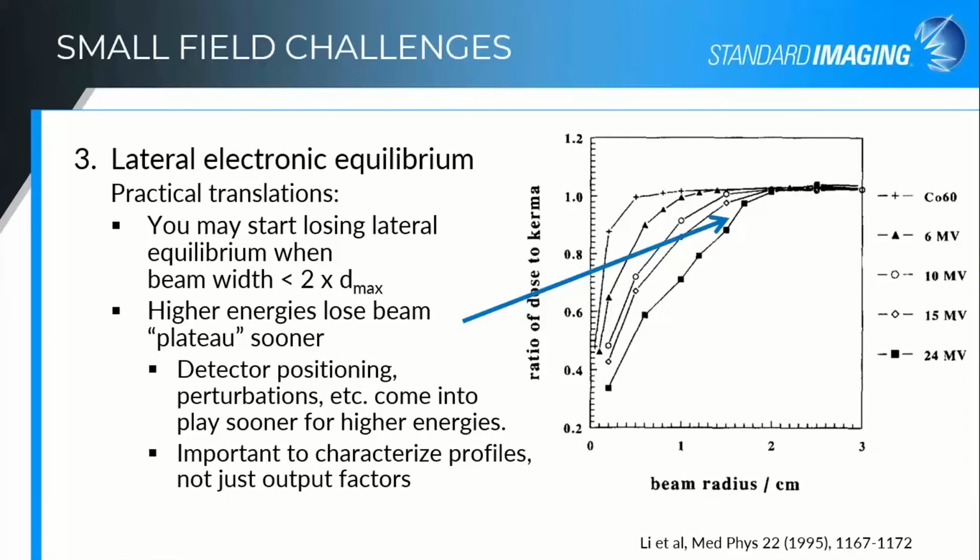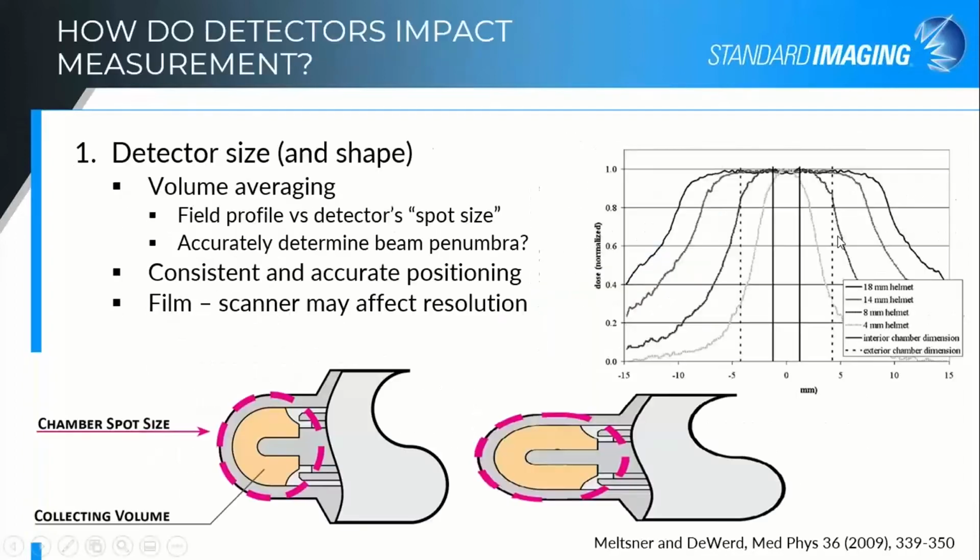As we see in some of these profiles, it's also very important to understand the profiles of your beam and not just output factors, because the shape of that beam affects your volume averaging, affects your lateral charged particle equilibrium, and therefore affects your measurements.